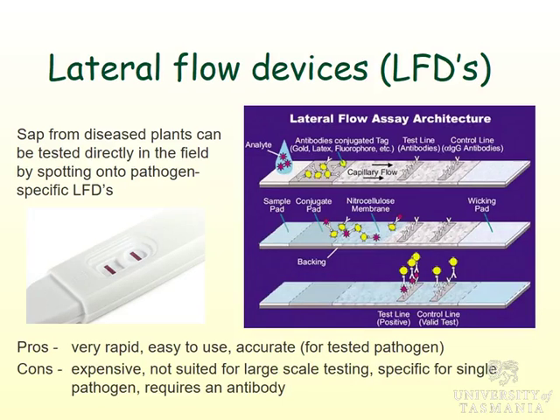But if you've got a brand new virus, a brand new agent, or one that's not that common, and there isn't a commercial antibody to it, you can't do any of these serological tests without an antibody. So you either have to make it yourself, which is not easy, and can be expensive and requires specific skills, or you use a different test. You can't do serology.